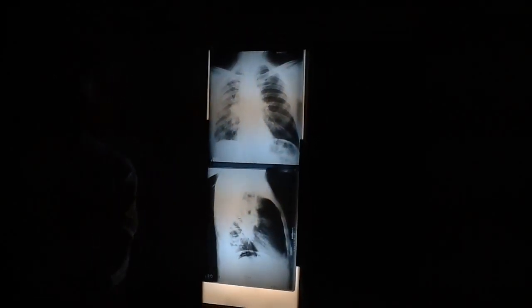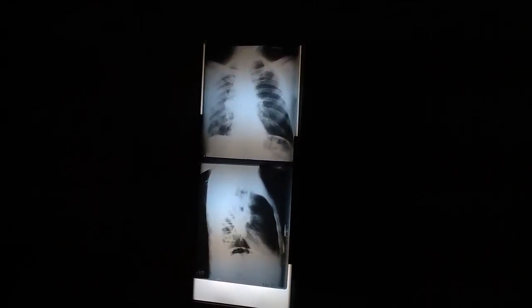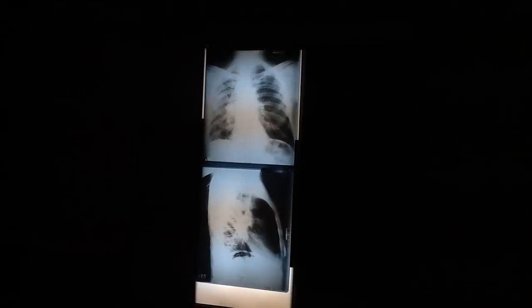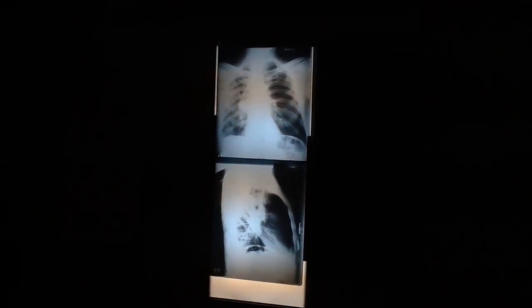So it's a central tumor. So which tumors are classically central? Bronchogenic. Squamous is central. Small cell is central. Adeno can be central. Large cells, classically peripheral. Adenos are more commonly peripheral. Squamous can be either. Small cells classically central. So we just think, all right, well, which ones are central? Well, it could be squamous. Might be adeno. Could be small cell. Large cell, no. Bronchiolar, doesn't look like this.